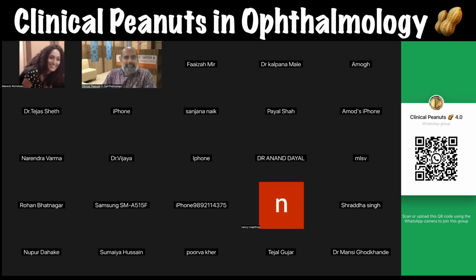If you have a patient who has had surgery somewhere else, and you know it's a yellow lens, just put another Alcon in the other eye. If you see it's a plain lens, just put a Technis. Are there only two toric lenses in the market? No, of course there's Rayner, there's Zeiss, there's all of them. But the ones I have experience with are only these two.